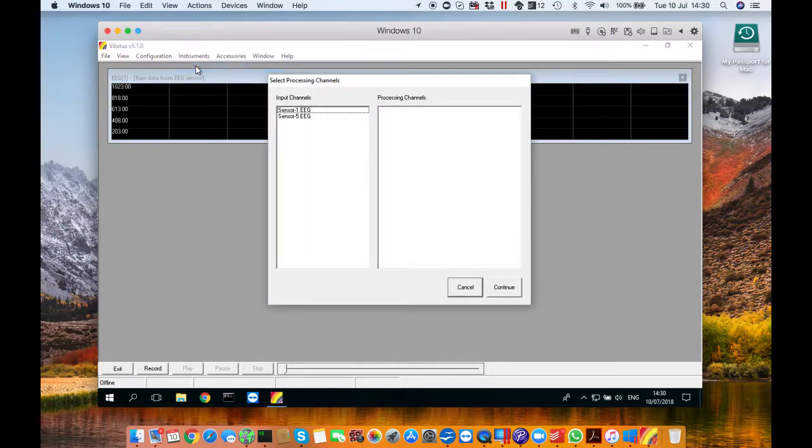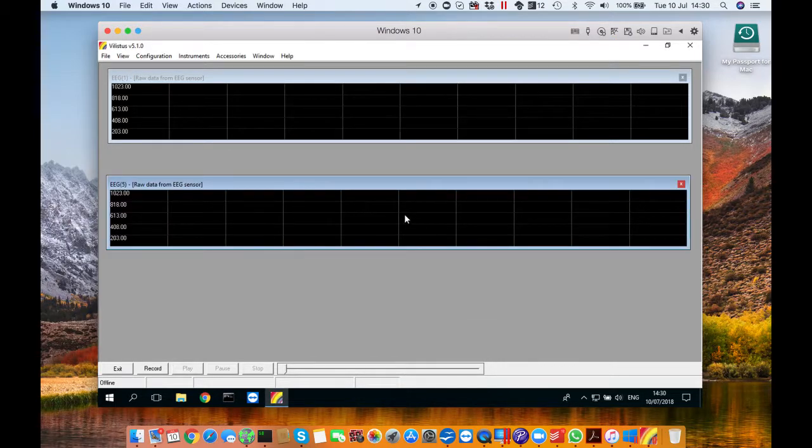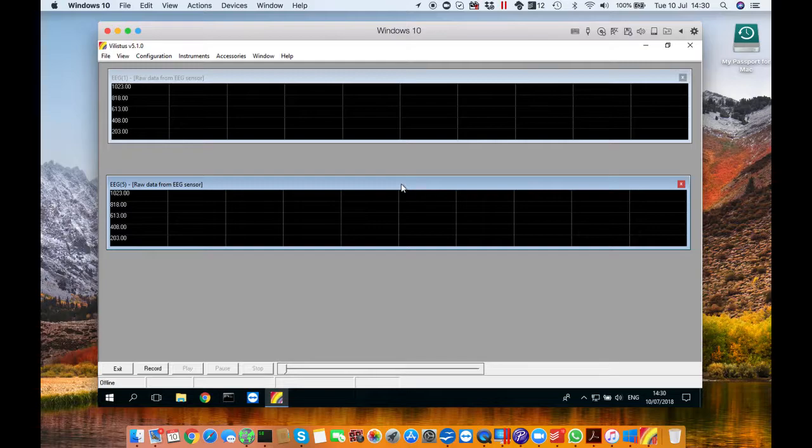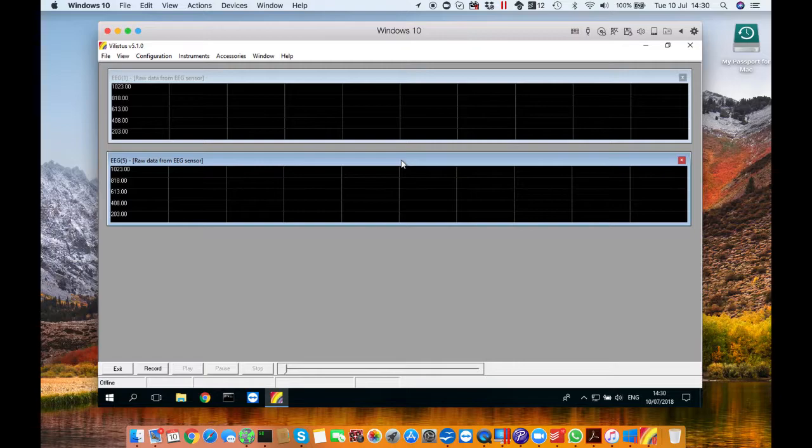Now do the same process for the second sensor and place it just below. The reason for these graphs is to check the signal quality from the electrodes. I'll show you an example of what good signal is later on in the tutorial.